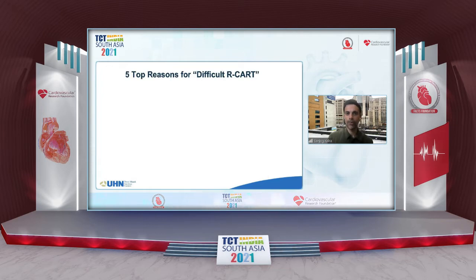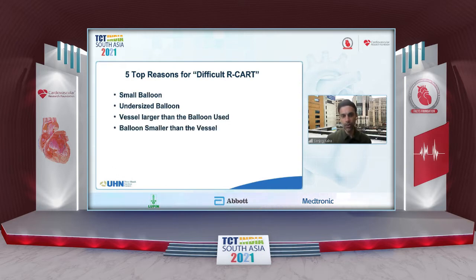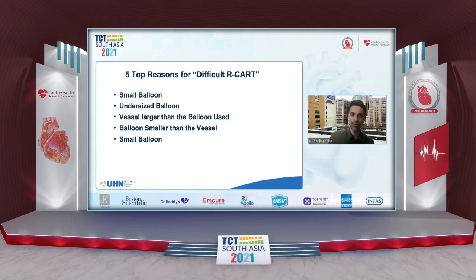So the top 5 reasons for difficult reverse CART: there's a small balloon, the balloon is too small, the vessel is larger than the balloon, the balloon is smaller than the vessel, it's a small balloon, and you're chicken. These are the words of my mentor, Dimitri Karmpeliotis.